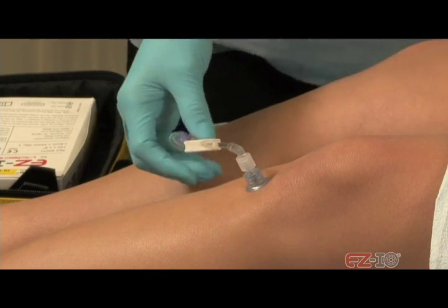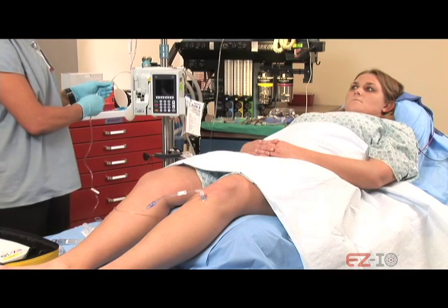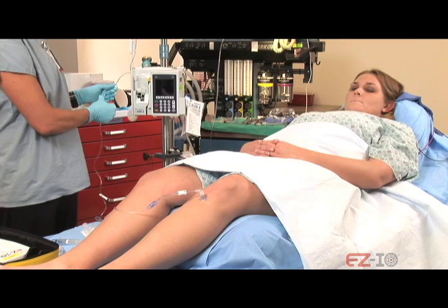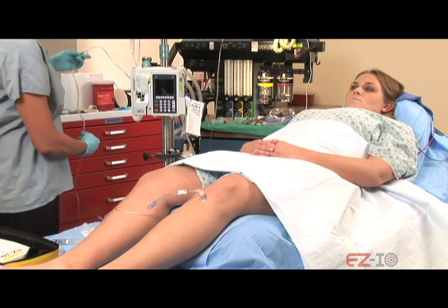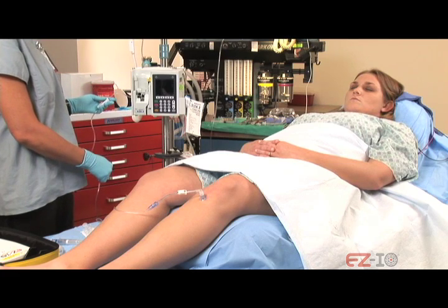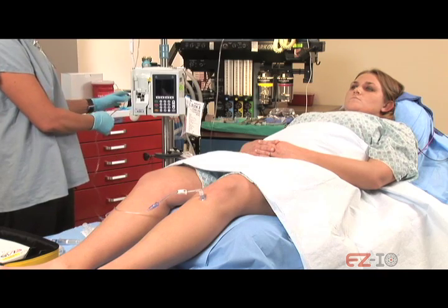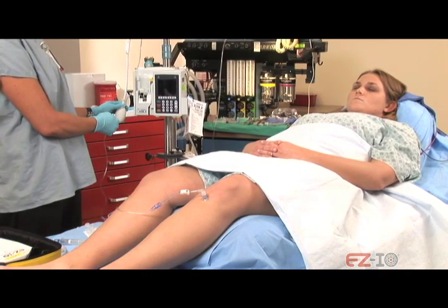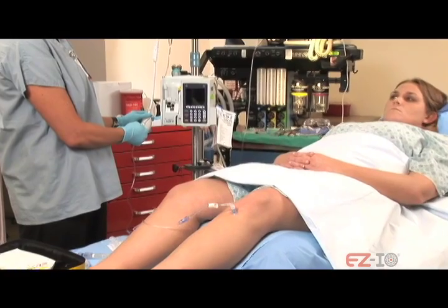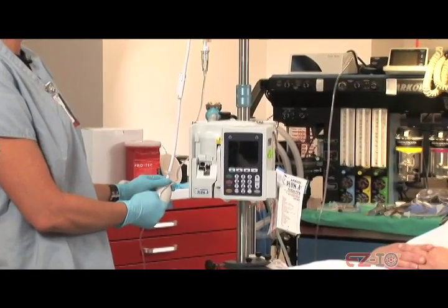I'm just going to let the IV push that medication in a little bit. Doing okay still? Scale of 1 to 10, what's your pain at? Like a 1.